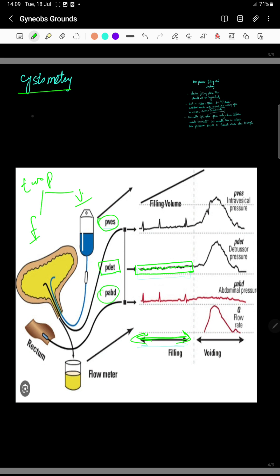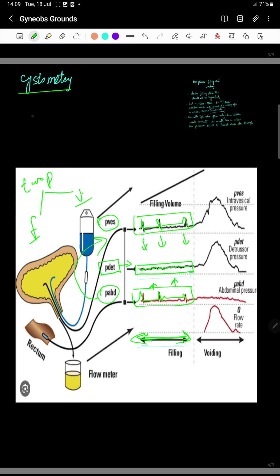Here is the vesical pressure and this is the abdominal pressure. Even when there is a rise in vesical pressure and a rise in abdominal pressure — such as during coughing, sneezing, or carrying something heavy — the detrusor muscle pressure remains stable throughout.